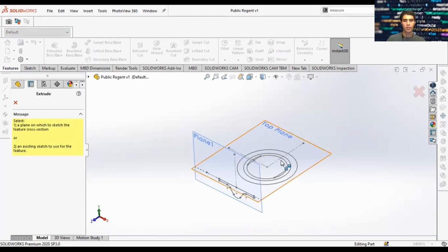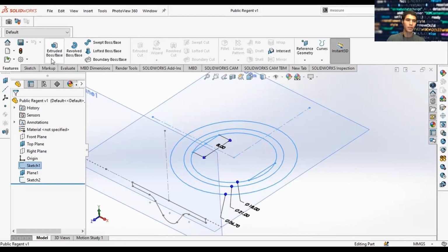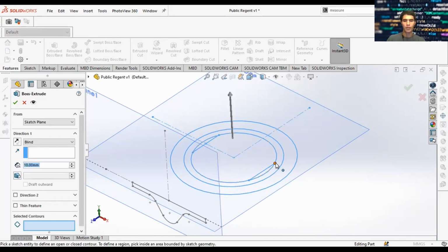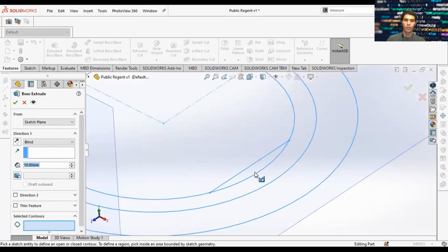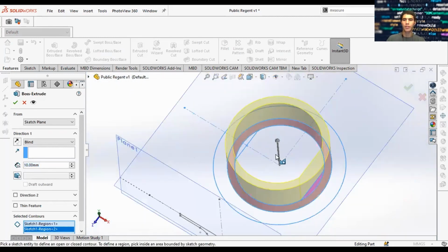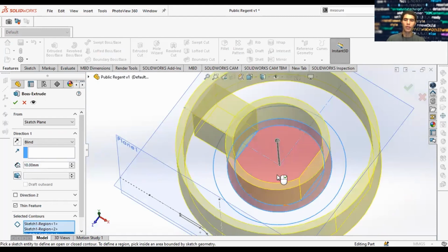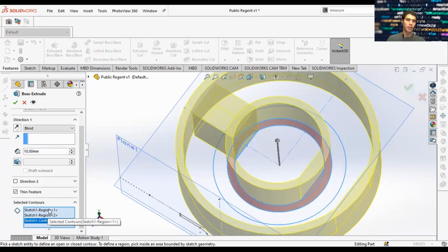So next you want to extrude boss base. Click your sketch on extrude boss base, and in this case it will be this one. And now you can select the contours, or the regions, you want to extrude. If it's a contour, it's everything within a sketch. So for example, if I click on this line, it will choose the contour of everything within this line, which will be this region. As shown here, selected contours.